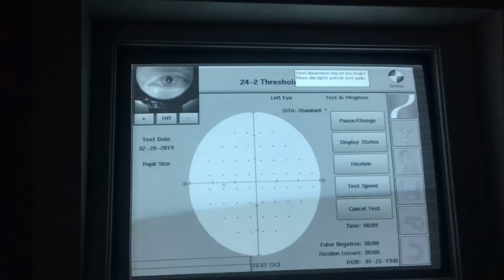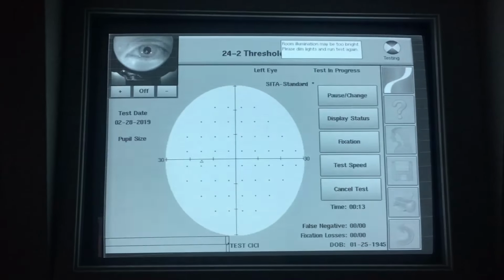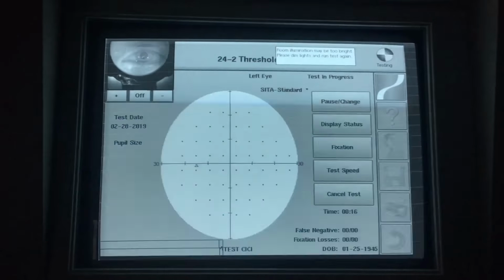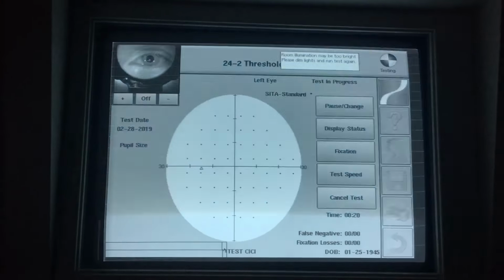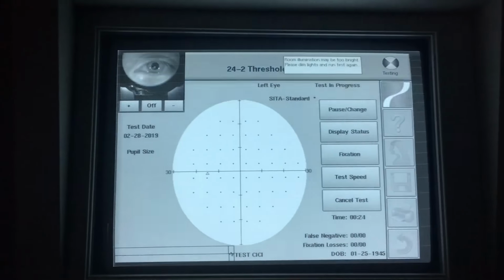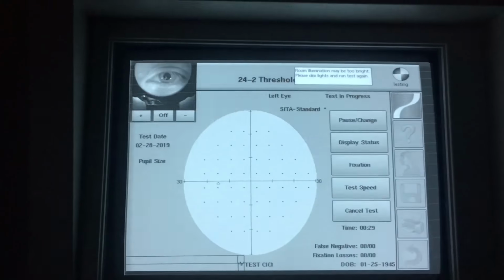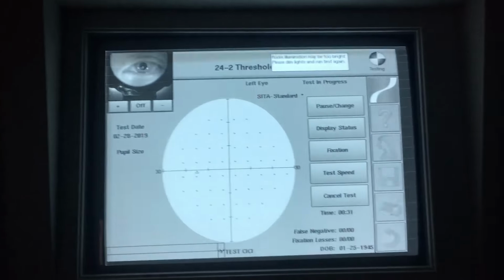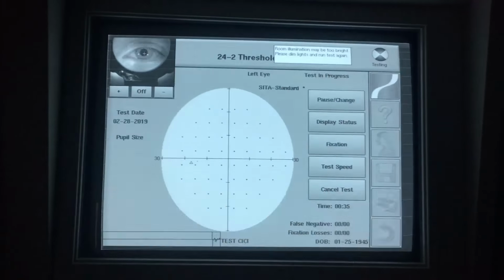Please note that we will do this entire thing in the dark, so room lighting should not be an issue because the overhead lights will be off the entire time. It's also important to know that you shouldn't talk during the test to distract the patient unless it's a very quick, encouraging word or to tell them to continue to look straight ahead. You're always monitoring where their pupil is, and you want that cross to be right there in the middle of the pupil.